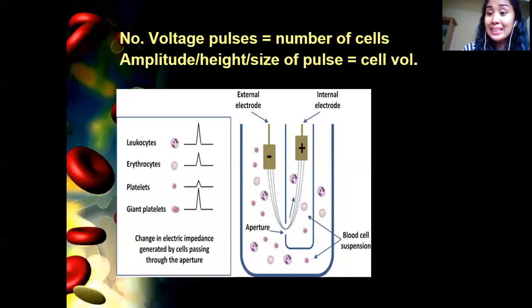That means the WBC count will go up, because giant platelets are not read as platelets. So they can be read as leukocytes. That's the problem there. Galing, no, class? So your role is to double check. If there are giant platelets in the smear, you have to correct the number of WBCs.